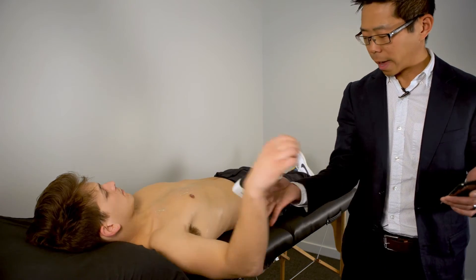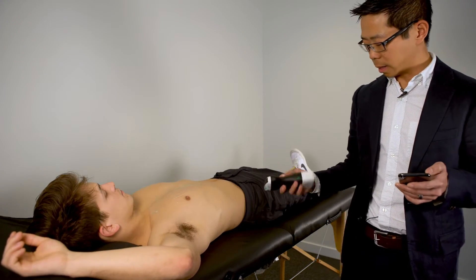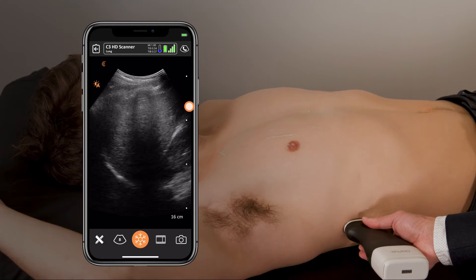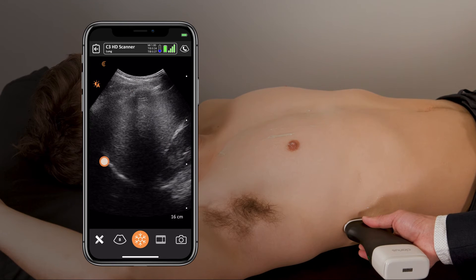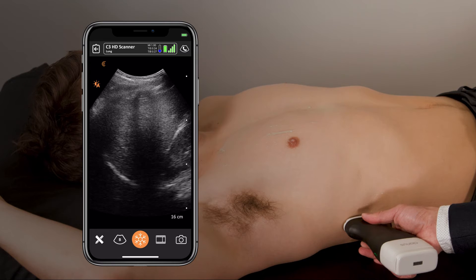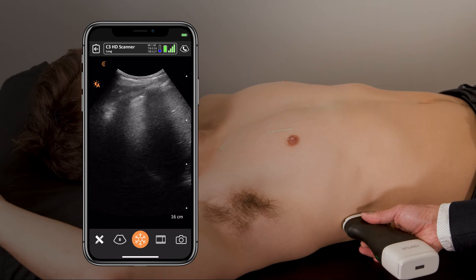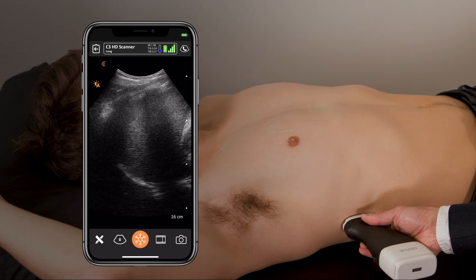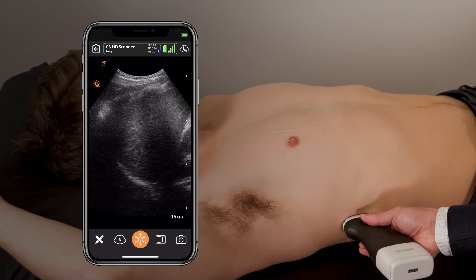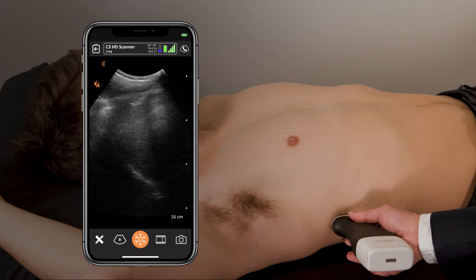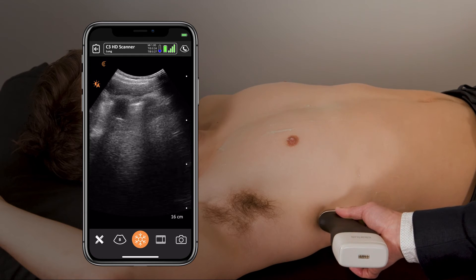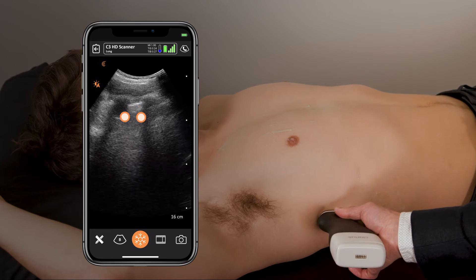For visualizing the axillary area of the lung, start at the liver-kidney interface. The idea is to visualize the diaphragm, which is the hyperechoic bright curved line above the liver. You can angle or slide the probe upwards to identify whether a pleural effusion is present. In this case, there is not a pleural effusion.